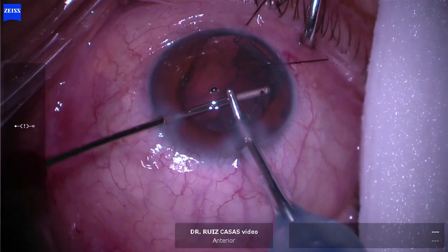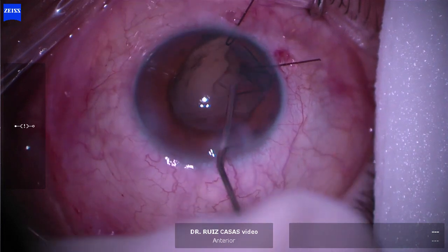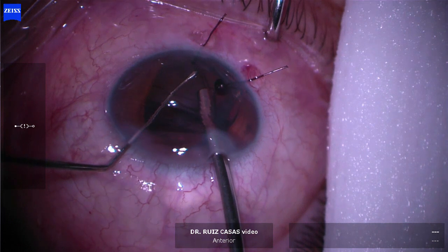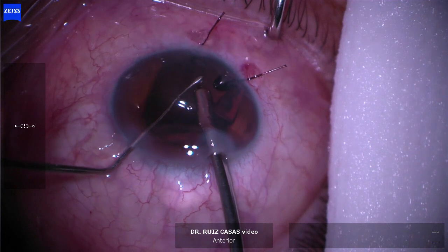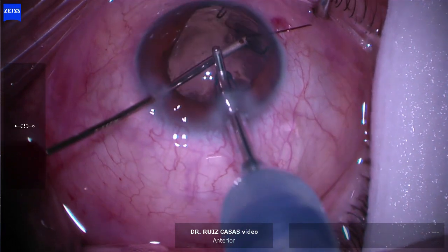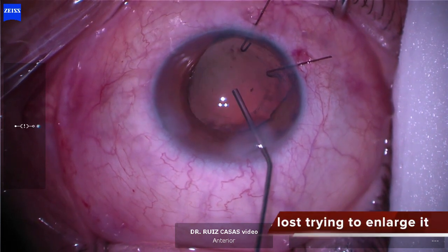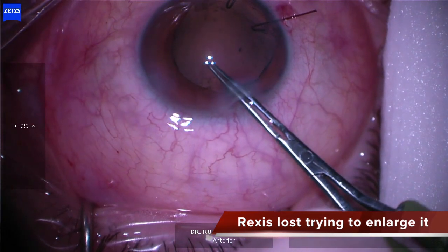As you can see, I'm holding the bag with iris hooks because I lack capsular hooks, and the last part of the cortex is very attached to the capsule, so I decided to implant a CTR. As you can see, it goes to the end of the capsular bag — you can see it inferiorly — and now I can remove the cortex remnants without any problem to the zonule.